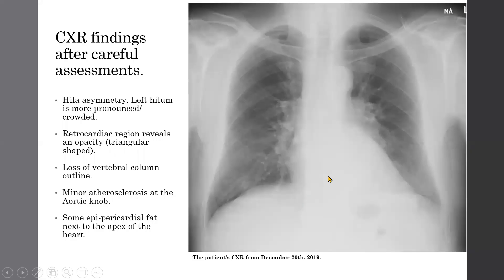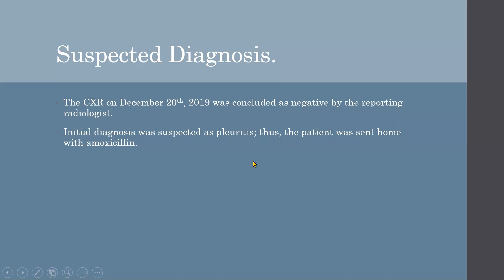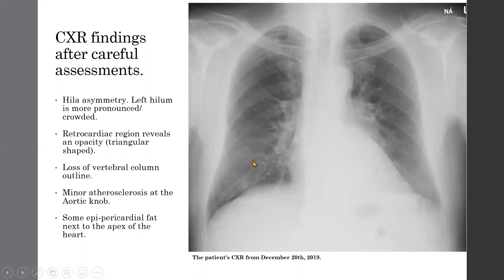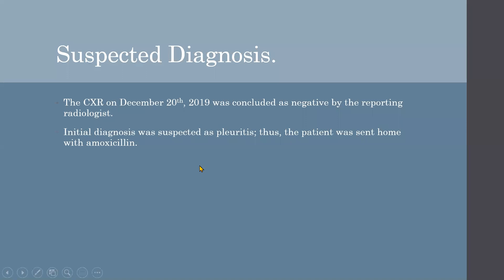Besides those two findings, other things to note include the presence of arteriosclerosis in the aortic knob, epicardial fat next to the apex of the heart, and the left hilum which seems more pronounced. The reporting radiologist missed all these findings and concluded the chest x-ray was negative.